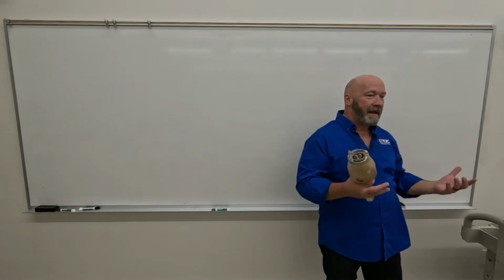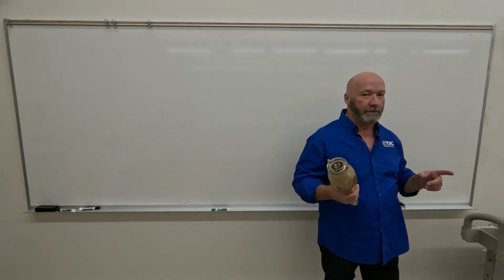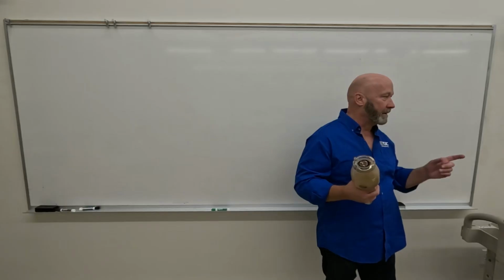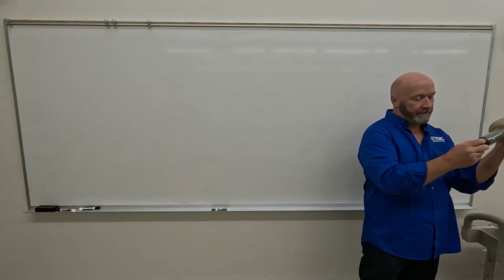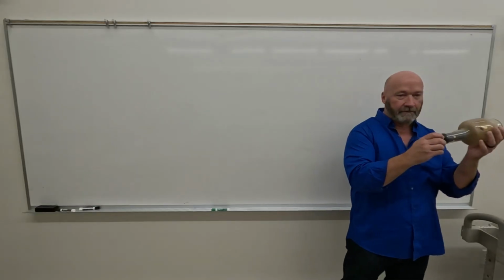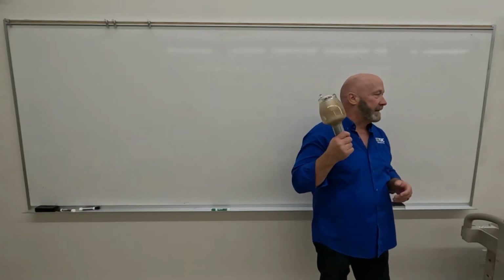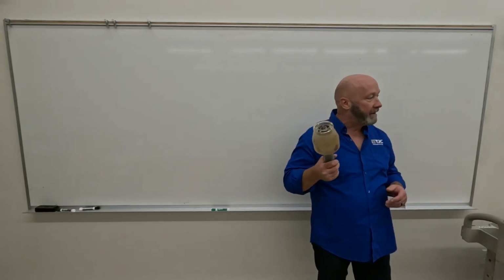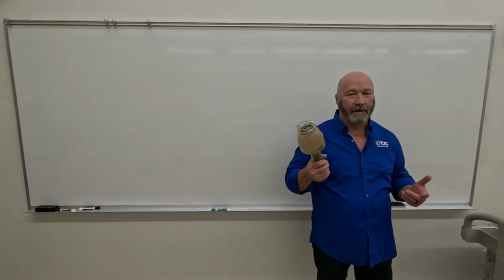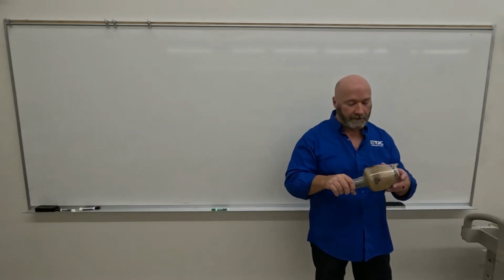So it mainly survived. The glass is still intact. It's just one of the ends of the tube. You can see where the glass is broken away, right here where, in this case, the anode end plugs in. So be careful with this. I'm saying that for a lot of different reasons. One is because we can't replace it and we don't have another one. Well, we do have a couple of other ones, but this is the most intact one we have where you can see the components well.